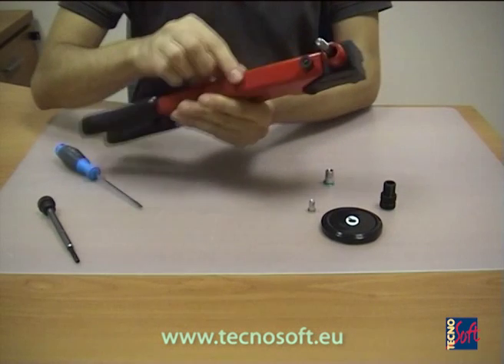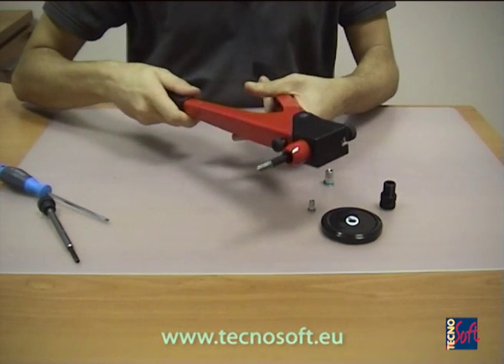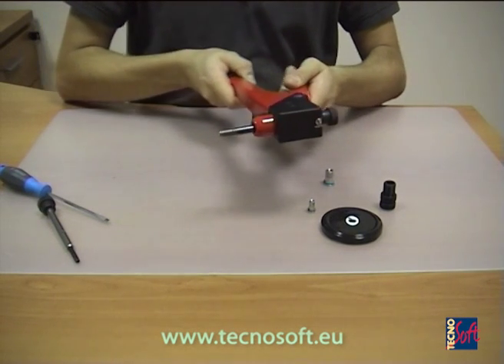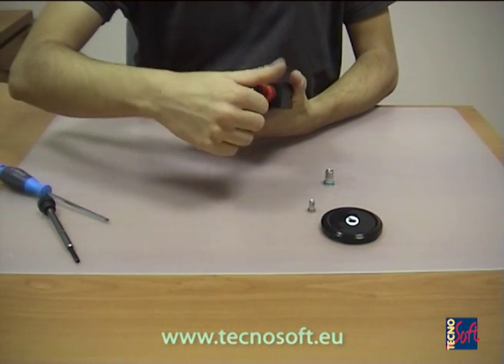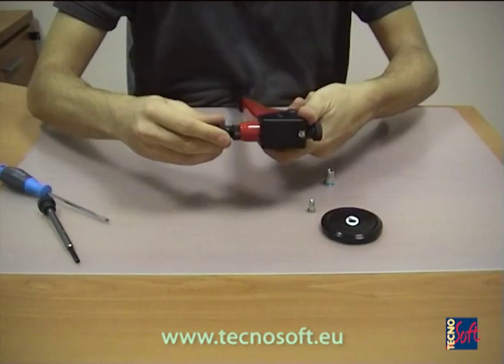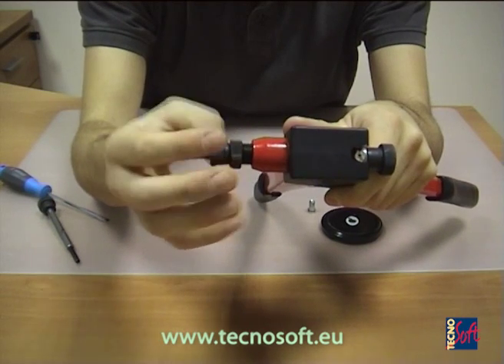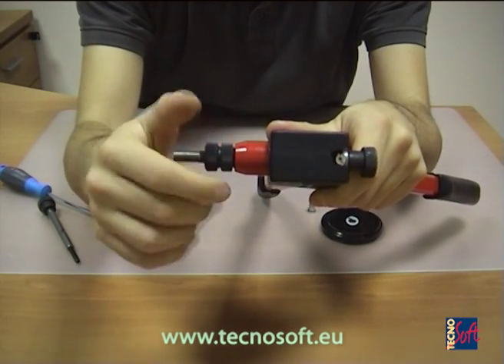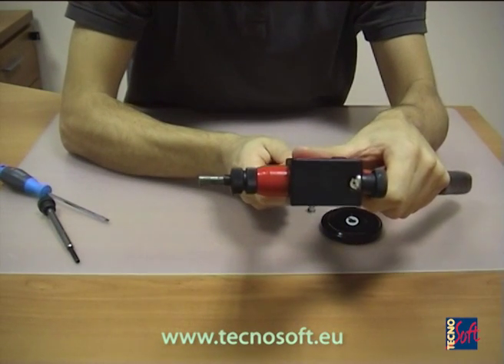Now release the front screw to open the riveting tool. Block the pivot inside the tool using the proper adapter — you can recognize it by the proper diameter. When you screw the adapter, remember to leave four to five millimeters of the pivot outside, so as to be able to fix the rivet on the surface.